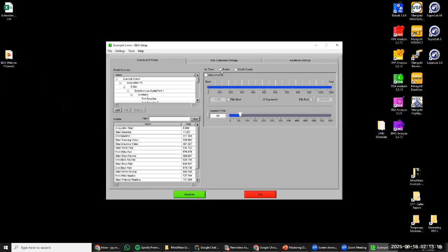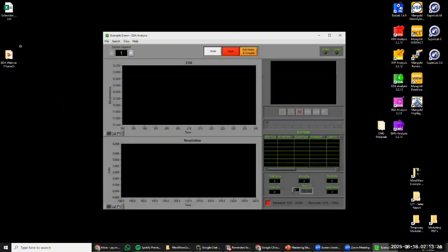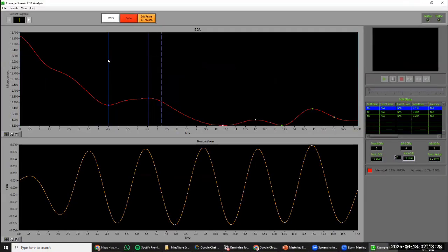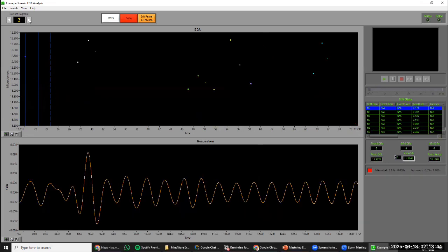So if we were to switch this to something that might be more helpful for us, we can say, let's just use all of these events, just for example, that we want to occur on the screen. So now here's my event of that section, and this is still saying that it is not event related because it doesn't fall within that 1 to 3 second window. Again, 1 to 3 seconds afterwards, we don't see that change. But as we go through here, we can see this one right here being too close, right? So that trough not taking a second before it occurs.